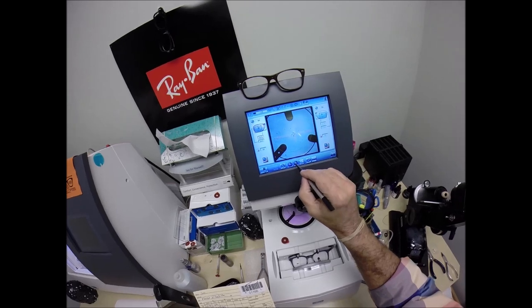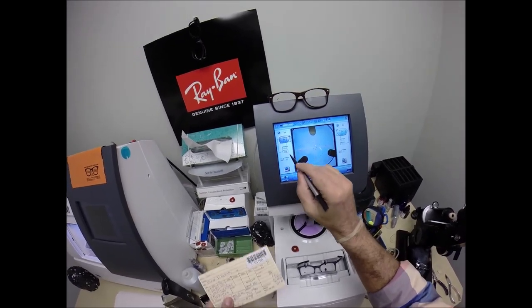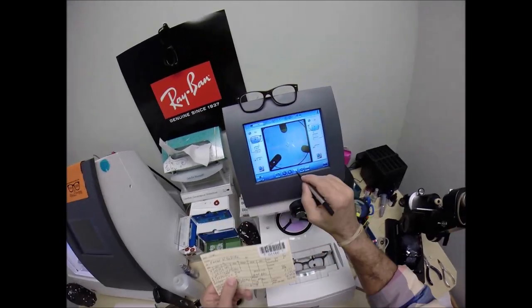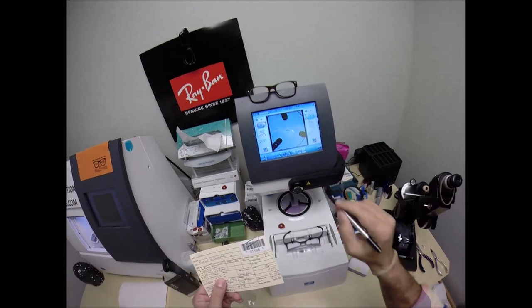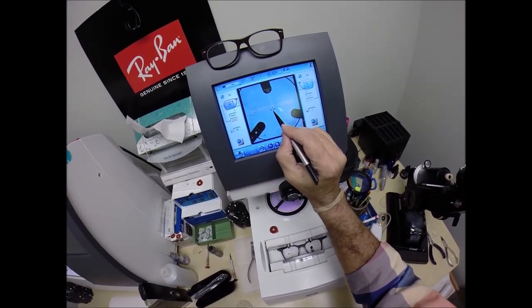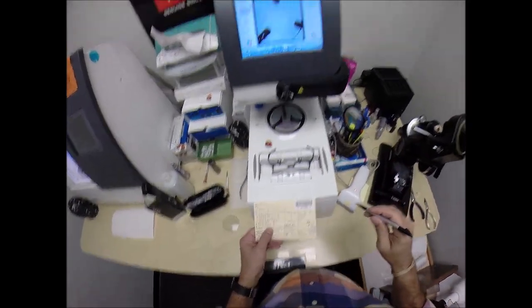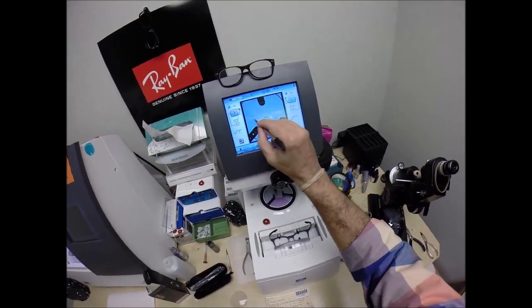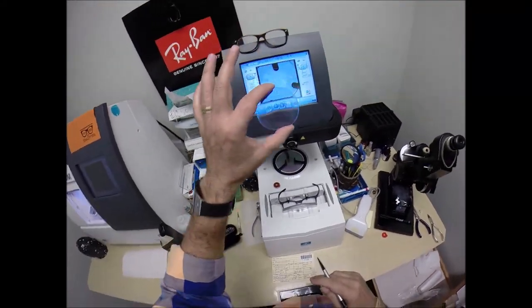I need to raise the optical center up to 23. That is where your invisible bifocal will begin, and sitting directly in front of your pupil. This blue cross is the geometric center of the frame. Your eye is just above that, inside the orange crosshairs. Just like the crosshairs of a scope, I measure vertically and horizontally to make sure your lens is dead center in front of your pupil.